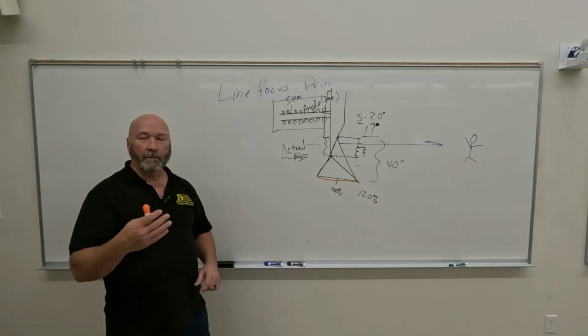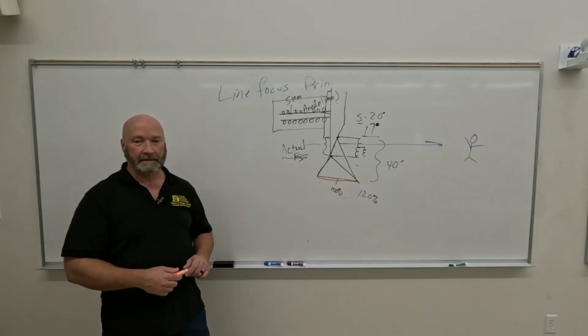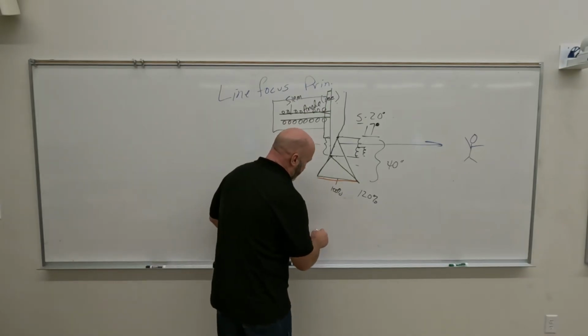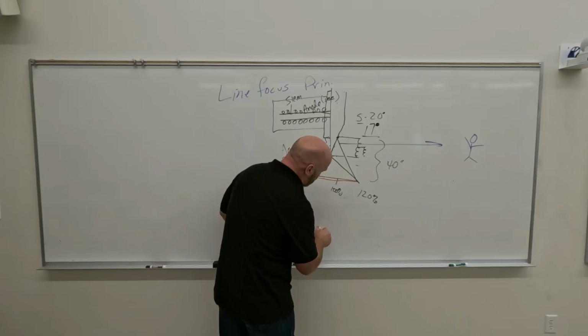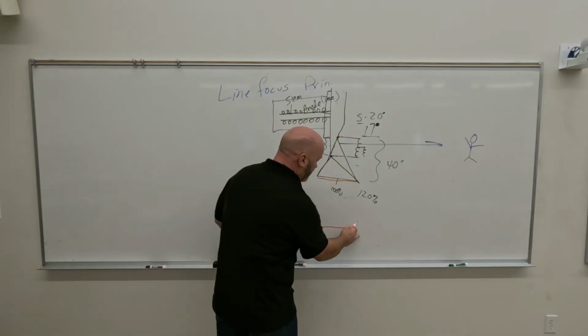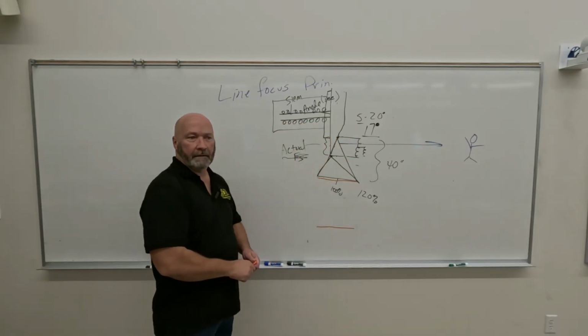Right? Now we want to do a chest X-ray. What distance do we want for a chest X-ray? 72 inches. So now my image receptor, which is the same size, is going to be that big. It's roughly the same size, right?